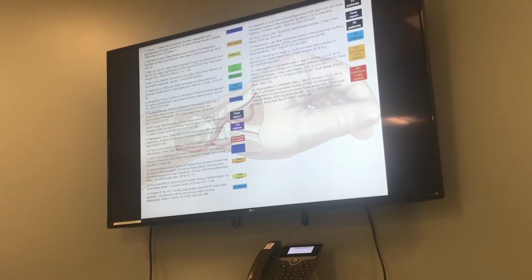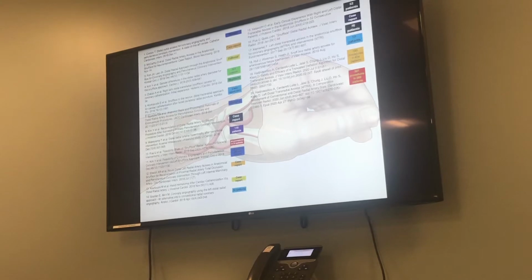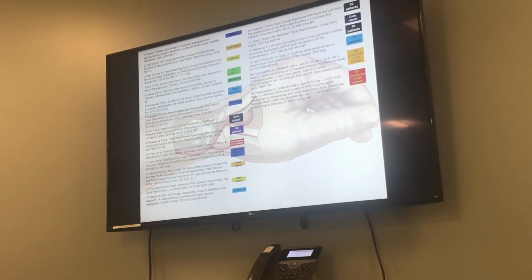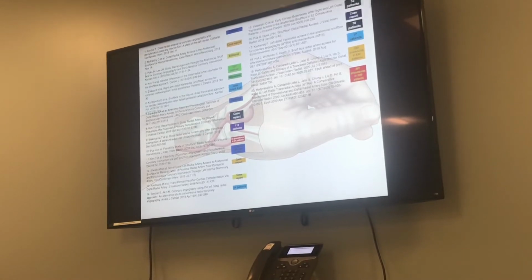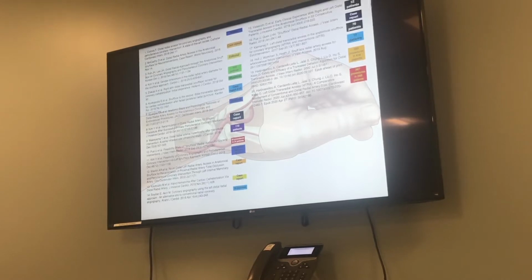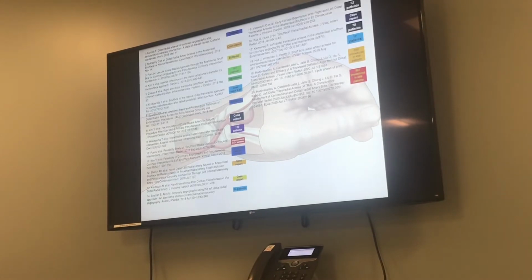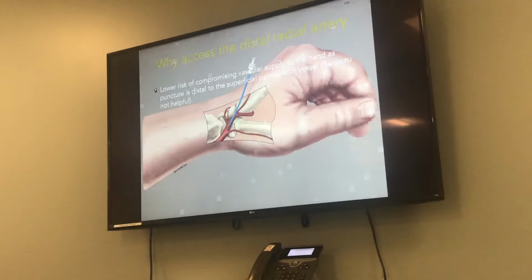And the good thing with the snuff box access is it's not just radiology that's doing it. Cardiology is doing it. Interventional neuroradiology is doing a lot of it. So a lot of strokes, not really in BC, but in North America and in the US, are being treated through the snuff box as well, because it's such a safe access site. So, if you look at the data, there's all 3 specialties producing data at the same time.